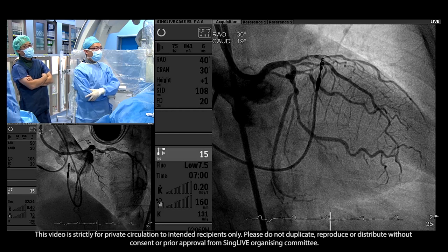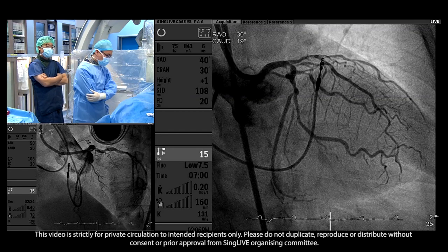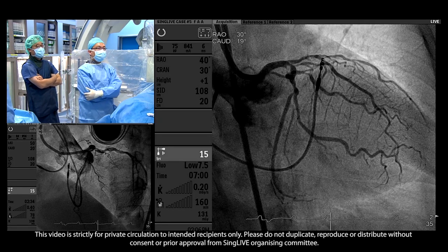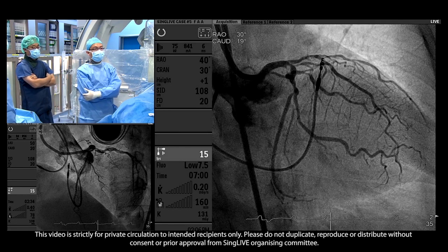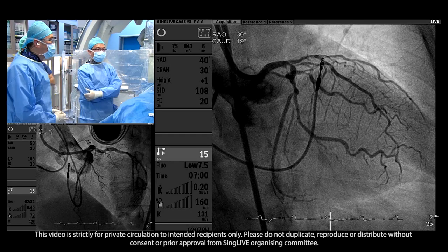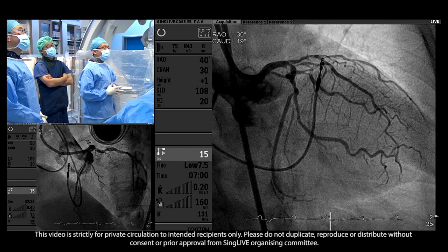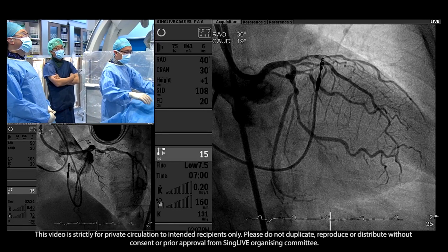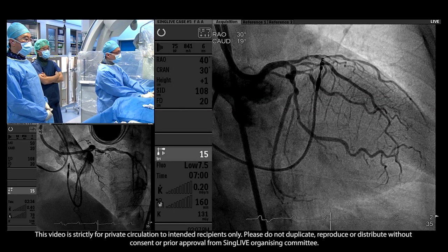In terms of patient selection for Impella, I think it can be helpful, certainly where there is a major cost consideration, to measure the left ventricular hemodynamics. A simple measurement at this point would be left ventricular end diastolic pressure. If you've got somebody with a very high EDP, above, say, a 15 to 20 threshold, you know that the moment you start working on the left main and they get any slow flow, they will become hemodynamically compromised very quickly. So if you've got an EDP over 20 and a mechanical circulatory support device available, then I would prefer to put it in up front rather than put it in under duress when the patient is decompensated.